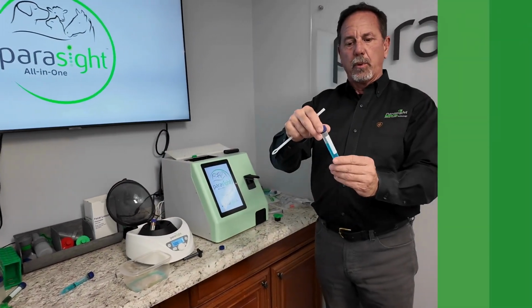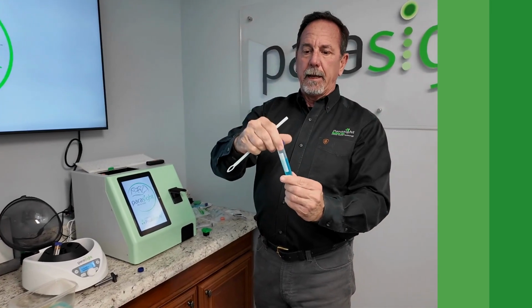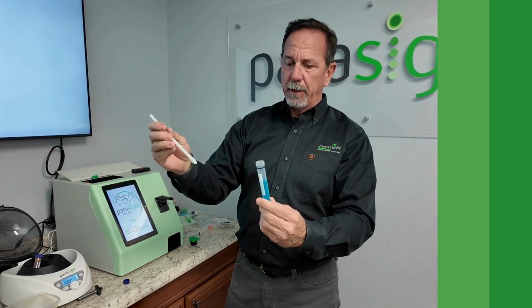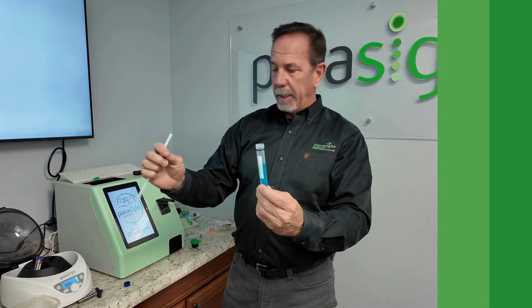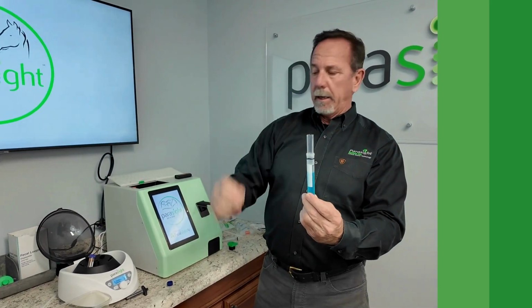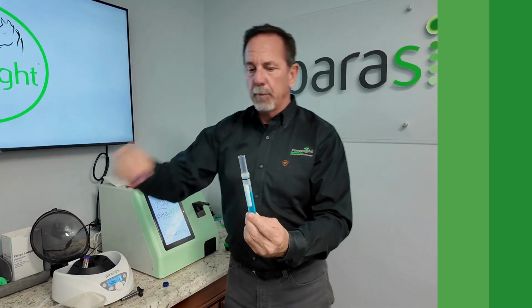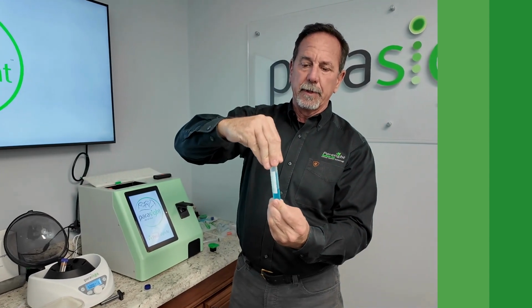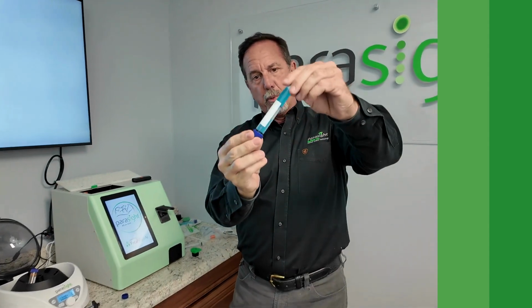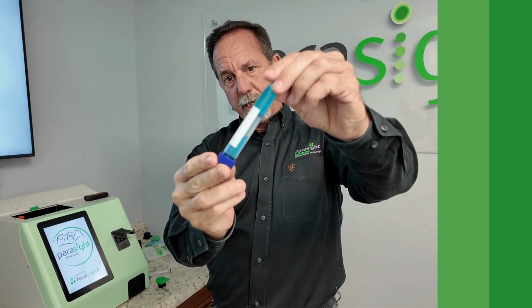So you'll go ahead and pour that out. You're going to take then, as it comes out, after the 1 minute spin, just like you normally do, you're going to go ahead and then put in the egg separator. Again, put that in, go ahead and just push down from the top. Go ahead and close that off. Remember, that allows you to pour the proper amount into the machine.